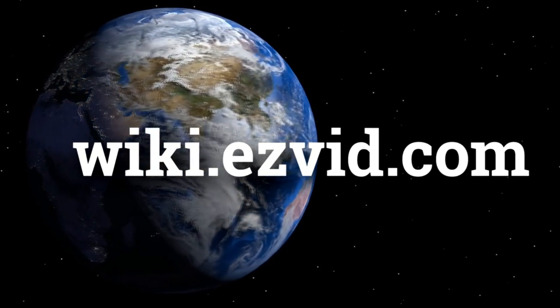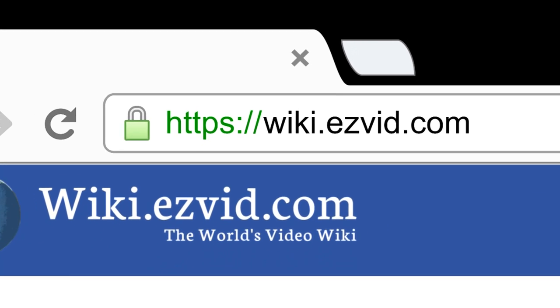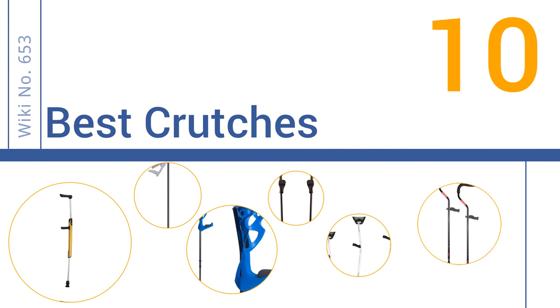wiki.easyvid.com. Search EasyVid Wiki before you decide. EasyVid presents the 10 best crutches. Let's get started with the list.